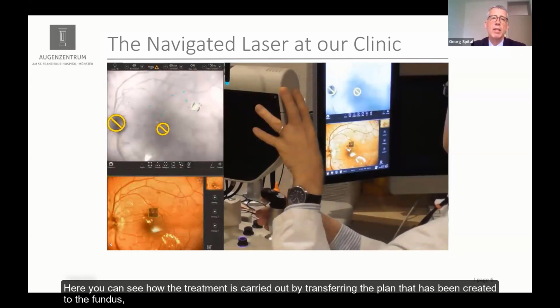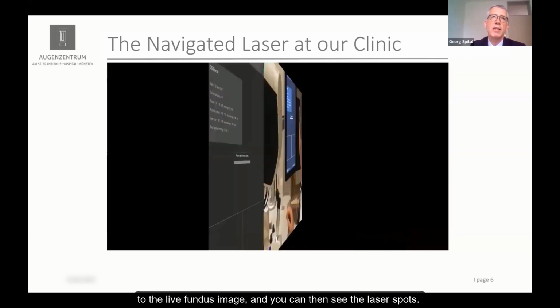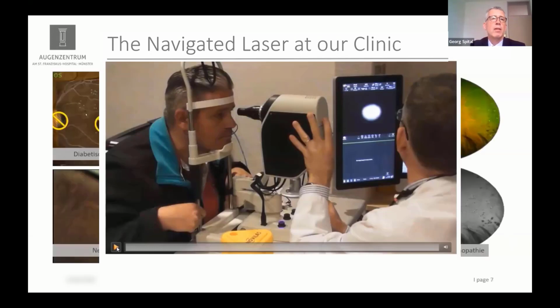Here you can see how the treatment is carried out by transferring the plan that has been created to the fundus, to the live fundus image, and you can then see the laser spots. It is important to say that you should wait a few minutes after laser spots have been applied to assess their strength accurately.